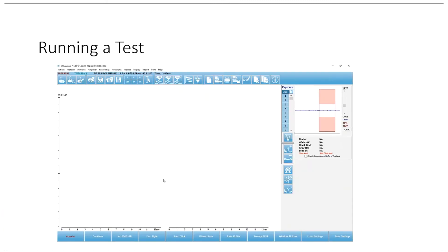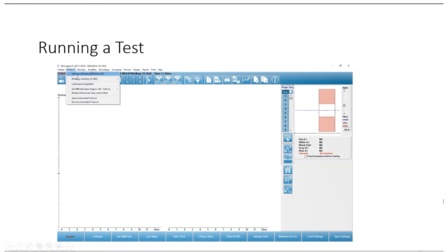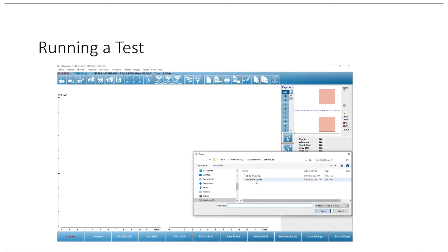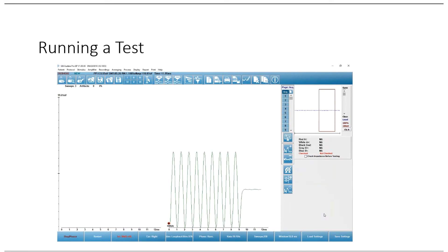Once connected, you're ready to run the test. I recommend creating a patient name for troubleshooting purposes — something like 'System Test.' Open the Audera ASSR or ABR module, go to Protocol > Execute Automated, select Loopback, and click Open. The test will automatically begin.